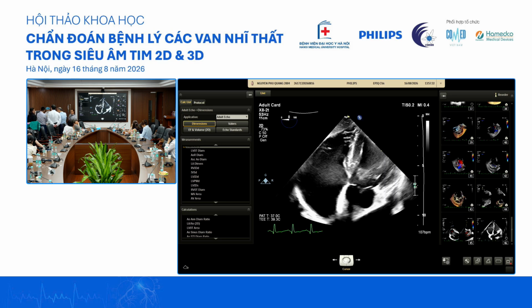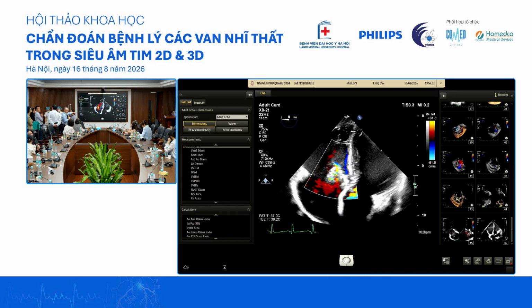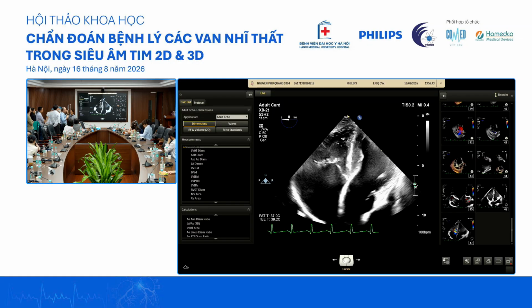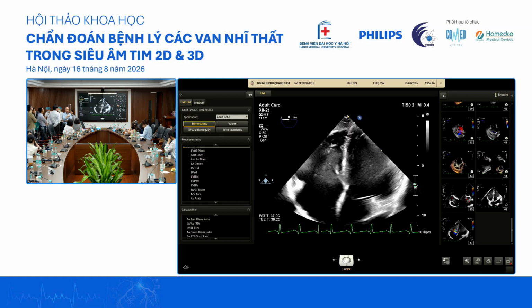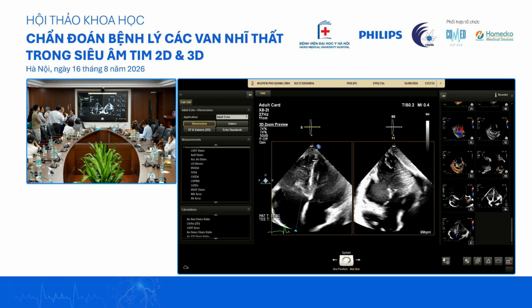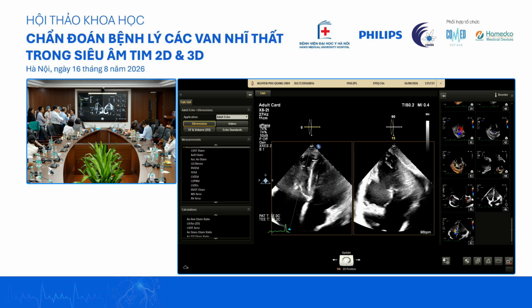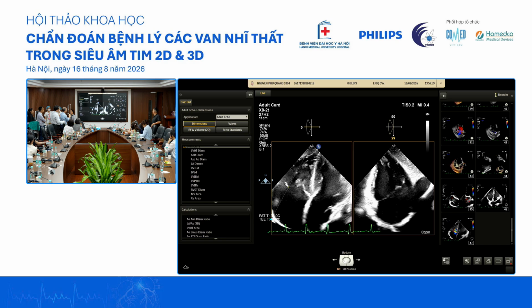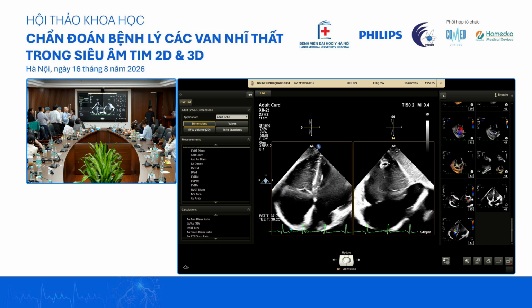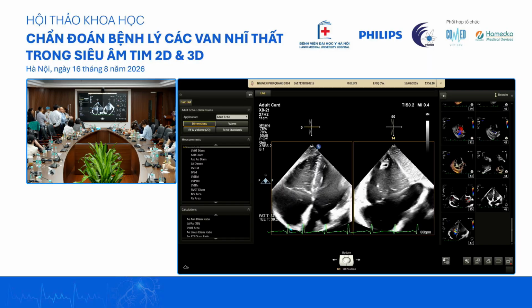transgastric. Oh, okay. See the septal leaflet here looks okay. No, the septal leaflet looks fine. So you're right, maybe it's because we always do on the left. Yeah, because the heart can tilt this way. But you can see that the septal leaflet is a bit restricted here. Not as free as the other. That can be because of the free wall. Once your free wall dilates out, you are tugging onto it, so you don't allow free movement. But I just want to make sure it's not hypoplastic.